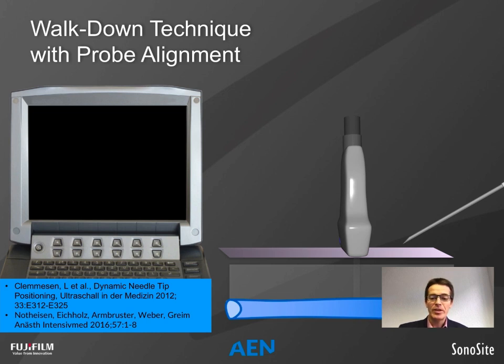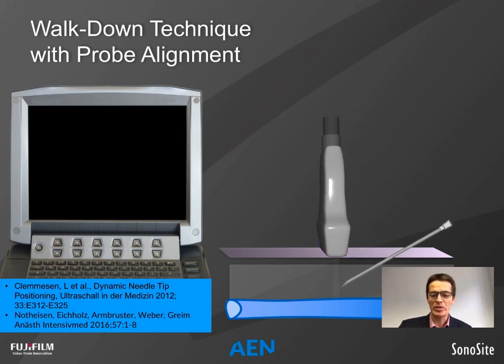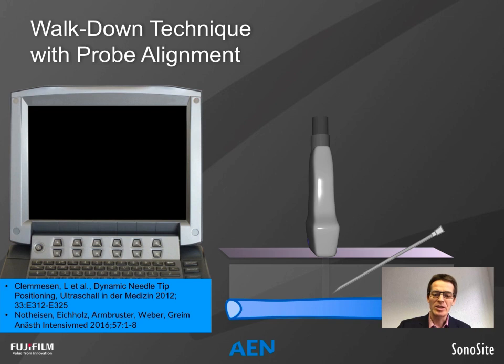The angle of needle insertion is basically the same, aiming at an early identification of the needle tip very close to the probe. So when the first reflex occurs, we stop the needle, move the probe, forward the needle, stop again, move the probe like here, and insert the needle a little more until we get to the 12 o'clock position. And then we can puncture the vessel. So this is a stepwise approach where either the needle moves or the probe. This is a very important piece of information: don't move both at the same time. Either the needle or the probe.